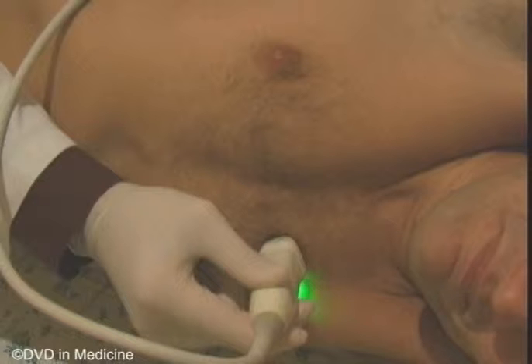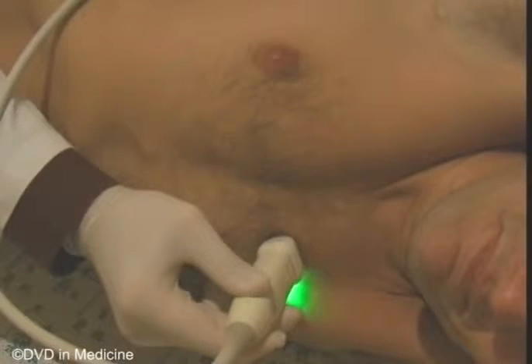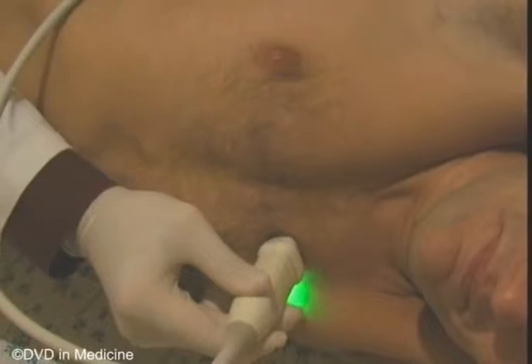After one has obtained a short axis view at the papillary muscles level, one can sweep the scanning plane a little towards the base of the heart. As a result, one will obtain a short axis view at the mitral valve level.